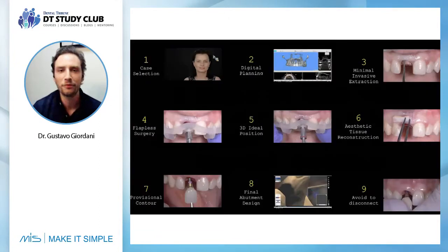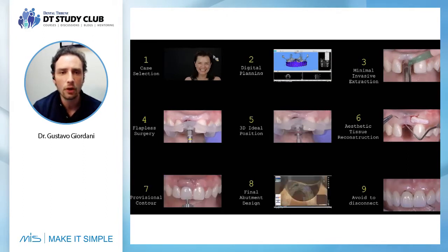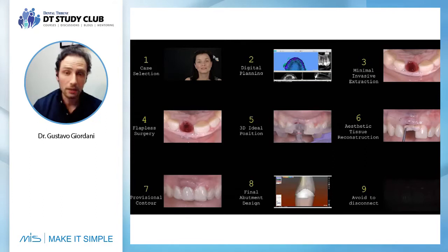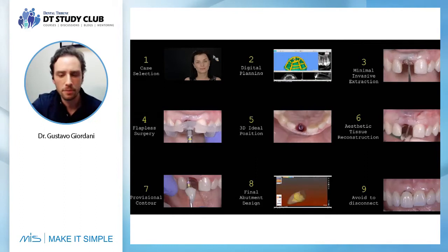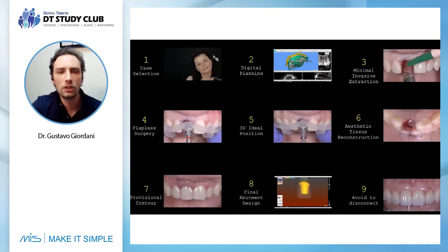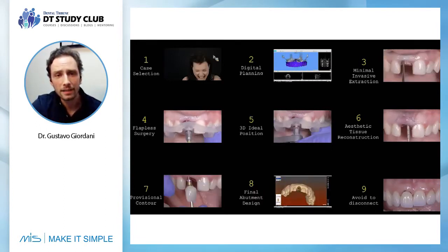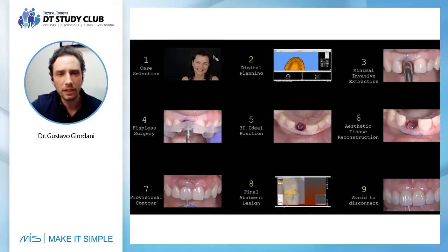This is our model for today. This is Monica, and Monica came to Timisoara to do aesthetic rehabilitation. She came to Florin, she came to Dentkov to do rehabilitation to have a better smile. And when this patient came to us, we started to do our digital clone. What is the digital clone? The digital clone is just taking pictures, taking videos, taking all the complementary exams to understand what we have from the patient and to try to create a treatment plan.